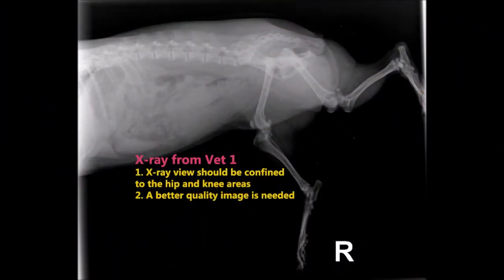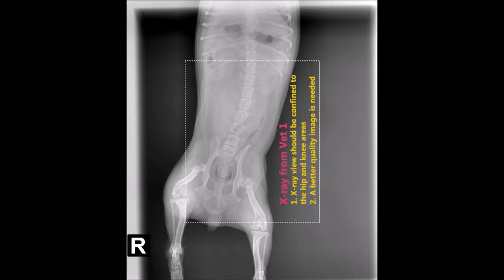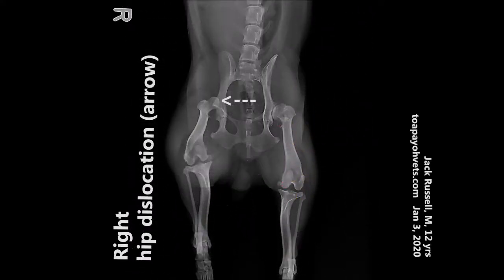This radiograph is taken from the first vet. On this case, the x-ray view should be confined to the hip and knee areas, and a better quality image is needed. So after the consultation, the doctor advised doing another radiographic examination for a clearer view. On the ventrodorsal view, you can easily see that the head of the femur is outside the hip joint socket.